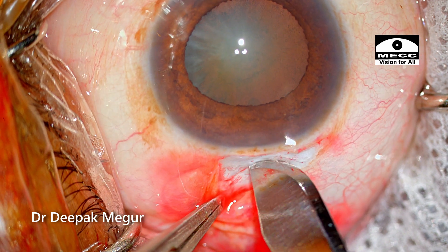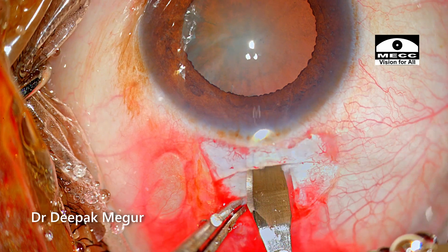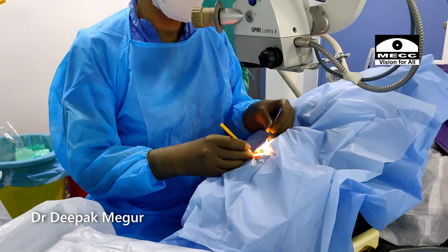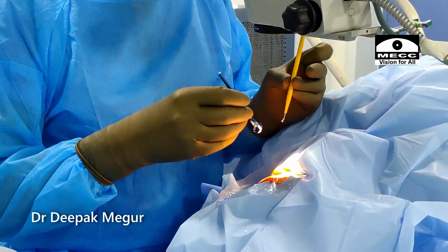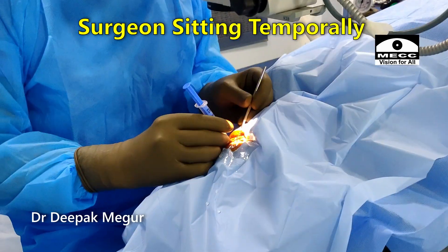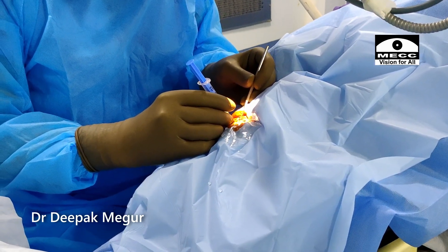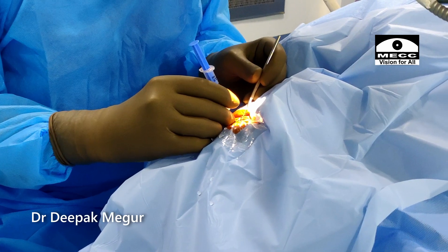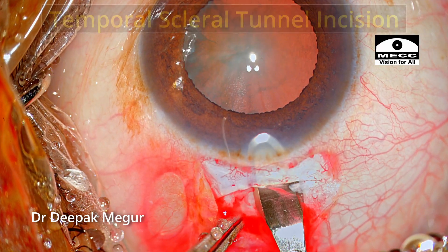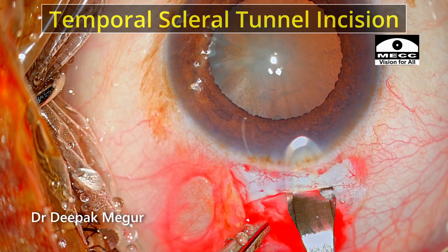Shifting to temporal incisions over superior ones is not very difficult at all. There will be certain apprehensions to begin with — for example, one would miss the patient's forehead and wonder how to support the fingers. But you will be surprised that one can adapt quite quickly. Once you are proficient with doing a good small incision cataract surgery with the superior incision, it's not going to be very difficult to switch to the temporal one. It's just a shift in mindset — that's all that is required.